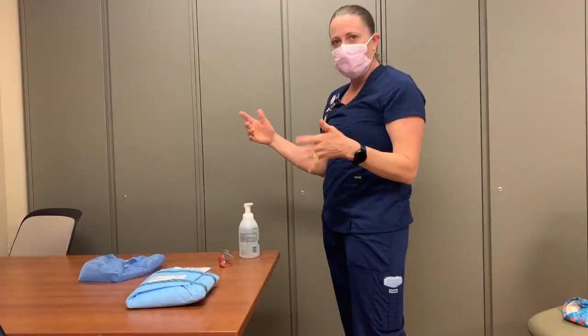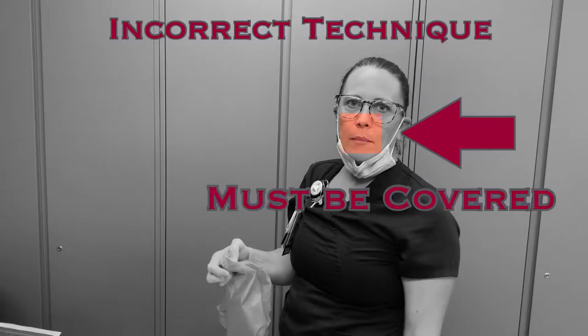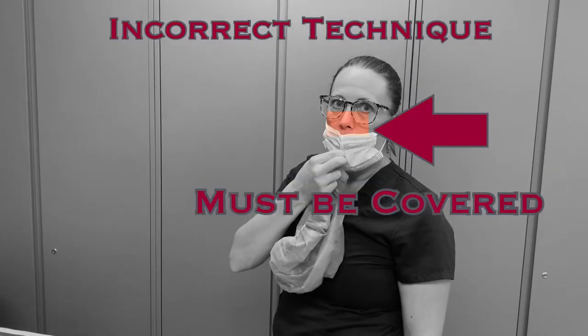Before opening any supplies, wash your hands. Then don your surgical mask — it must be in place before you open any sterile supplies. Breathing on your sterile supplies can cause contamination. The mask must be in place over your mouth and nose before continuing.